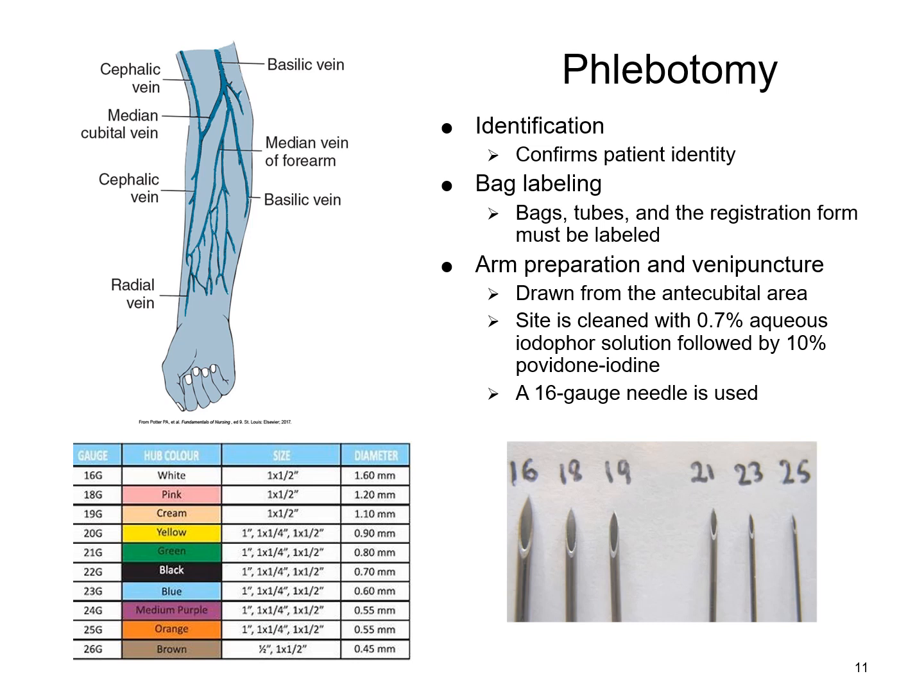Now, the phlebotomy process includes making sure that you properly identify and confirm the patient's identity, and making sure that the bags and things are properly labeled with the registration information. Donors are voluntary and they are kept anonymous, so it's usually a unique number that is associated with that bag that's going to include an ISBT type of labeling.